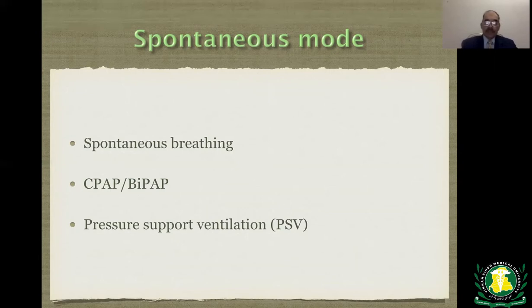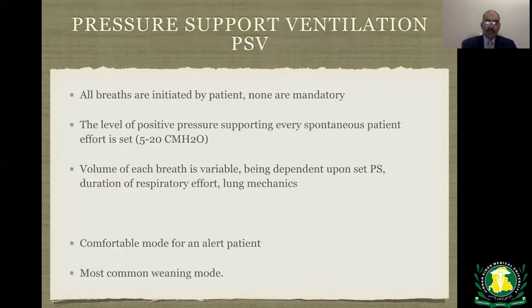Pressure support ventilation, PSV, same thing. All breaths are generated by the patient. None of it's mandatory. What the ventilator does is support the inspiration with whatever pressure support you have set, generally 5 to 20 cm H2O. So the volume of each breath is variable, and it depends on the level of the pressure support, duration of the respiratory effort, and lung mechanics.